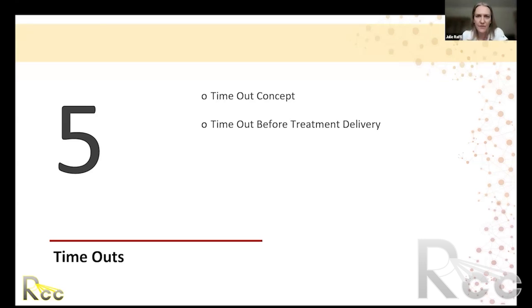Okay. The reference image in the patient's X-ray, in the patient's file: how can it be relied upon when there are biological changes in cancer? Yes, their planning image was taken at the time of simulation, and there may be changes during the course of treatment because we're getting further away in time from when they were imaged for simulation. That's something the physicians want to be aware of. You might notice tumor growth during the course of treatment on the imaging, in which case they might need to have their plan adjusted.